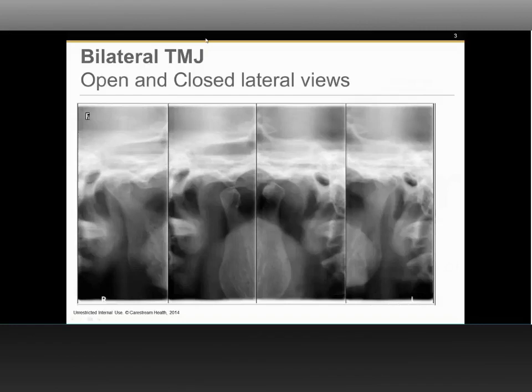That is exactly what it is. It is the third dimension, as I've mentioned earlier in our previous discussions. A 2D image is nothing but a two-dimensional representation of a three-dimensional structure. So one of the things that we lose is the third dimension, which is nothing but the depth. You can analyze the breadth, you can analyze the width or the height, but you're not able to assess the depth, which is the third dimension. And by moving towards CBCT imaging or any form of third dimensional imaging, that is one of the biggest advantages. You're able to now see that dimension which could not have been visualized on a static radiograph.